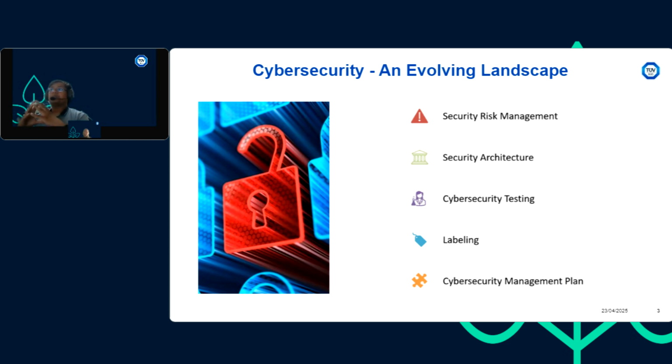Cybersecurity testing: you cannot deny the current situation, looking at attacks like ransomware, viruses, hacking of the system, and making devices go unresponsive during surgeries. To protect against this up to a certain extent, we will obviously need cybersecurity testing, where we look for vulnerability scanning, penetration testing, fuzz testing, and robustness testing around the devices.